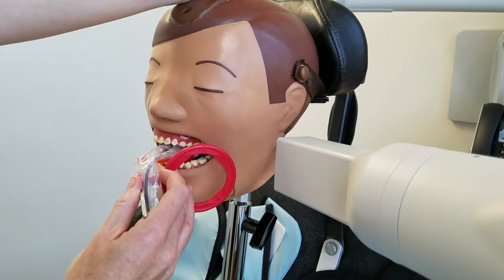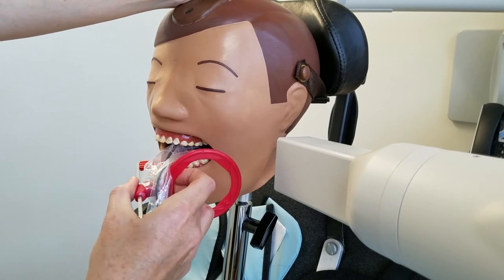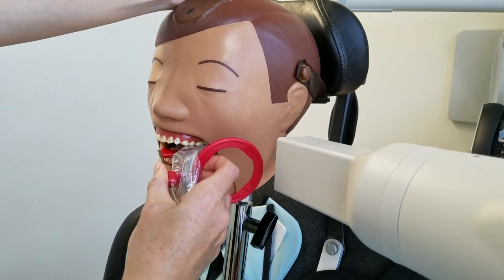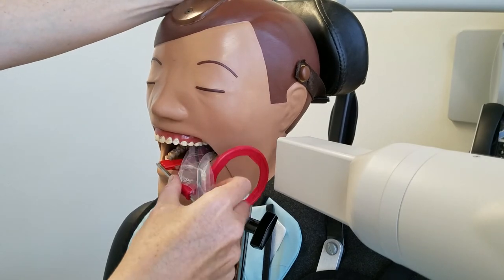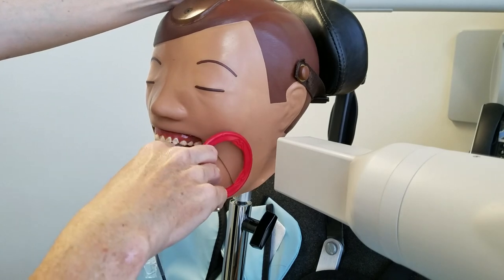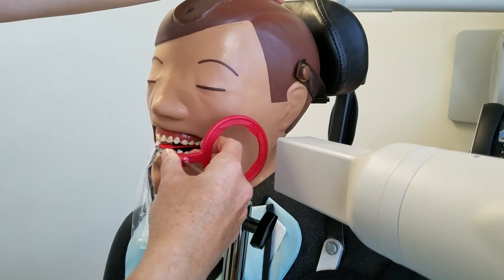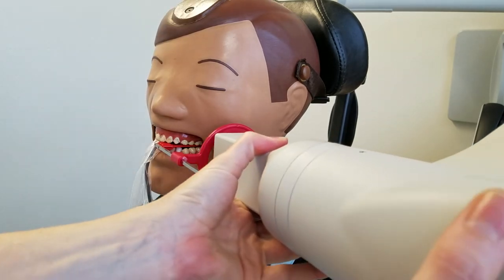For the next film, I'm going to pretend like I saw everything I needed for the premolars and then put it back for the molar shot. I'll center the second molar right in the center of the film, get my sensor cord out of the way, and then have the patient bite down and bring our BID over.